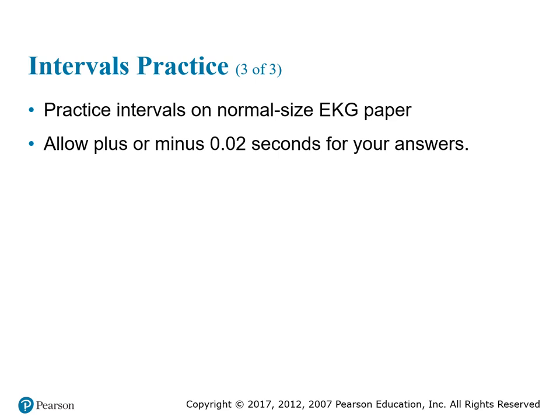Now, whenever I look at EKG graphs from a real perspective, just remember what I see and what you see. As long as we are within 1 to 2 blocks of my answer, you're still correct. So say if I come out with 0.20 and you come out with 0.18. Well, you're still 0.02 seconds within my scope. So you're still within 2. So long as your answer is within 2 of my answer, you're still in good shape.